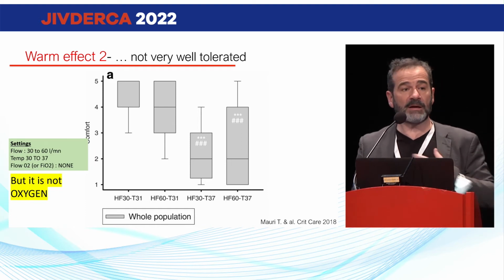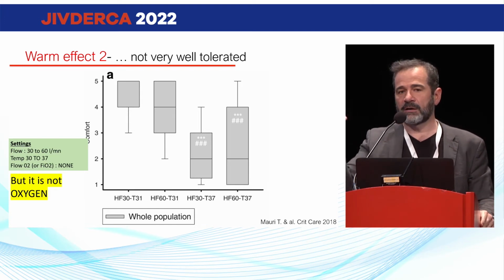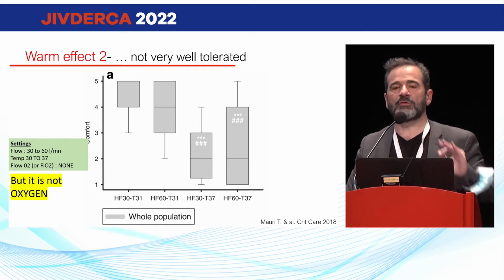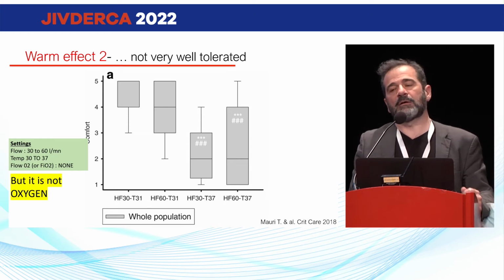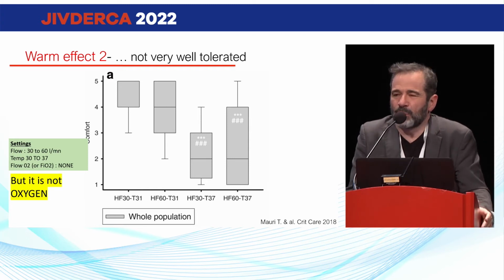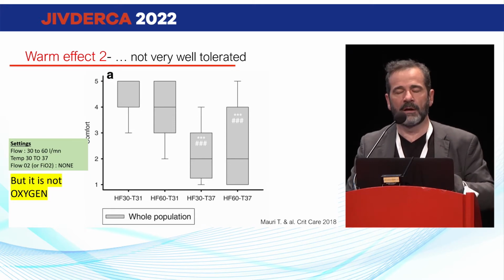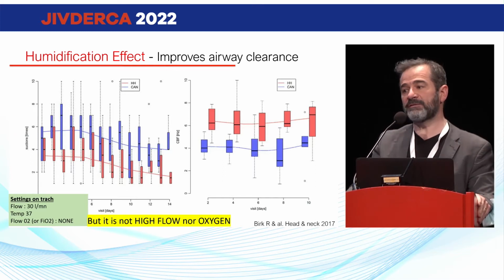And it's my problem in my rehab center when I saw the studies published by our Italian colleagues, Vitacca and colleagues. I immediately tried that in my patients, but they do not tolerate it. Especially, they do not tolerate the flow, especially when they open the mouth, and they do not tolerate the very warm air. In my rehab center, we don't use that because patients, exactly like in this study, do not tolerate it when you send a very high flow and warm air in the nose. Humidification.